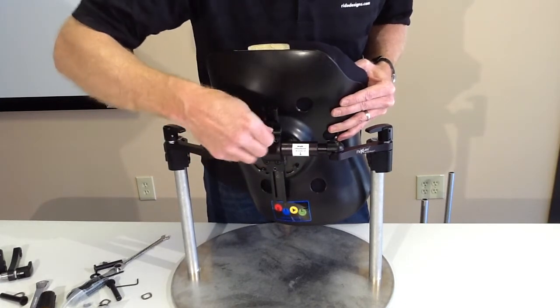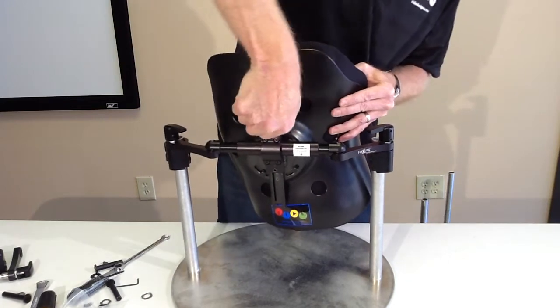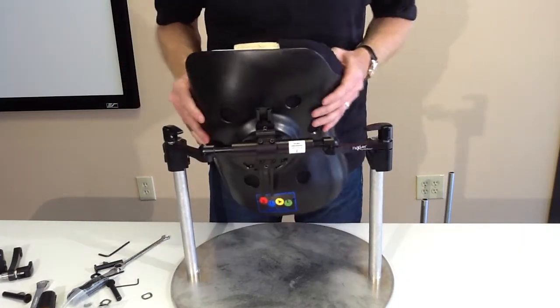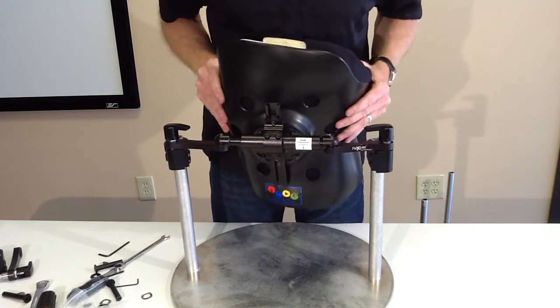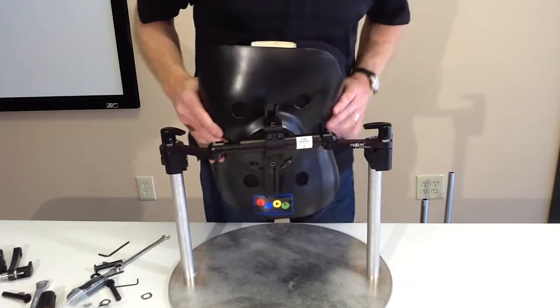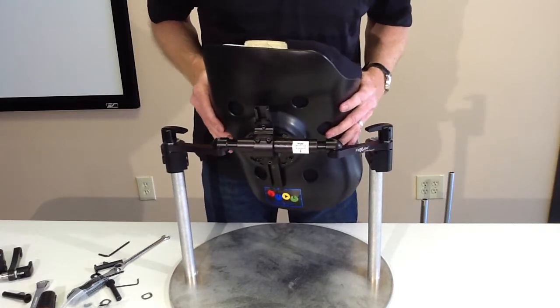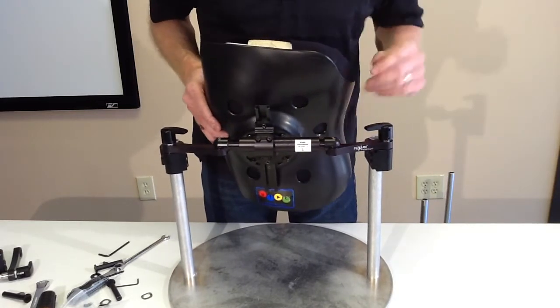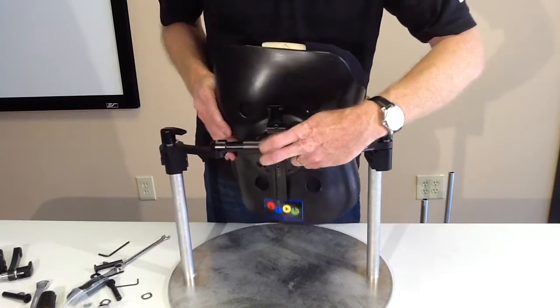So I'm doing this first, then I'm going to keep the other. So I'm just going to tighten down one. Now I've got all of the other axes that I can play with. So typically I've got somebody working from the front of the client and I am working with that client to find that sweet spot, recognizing I can move this back infinitely on all six axes.